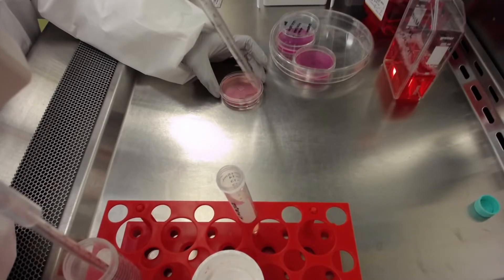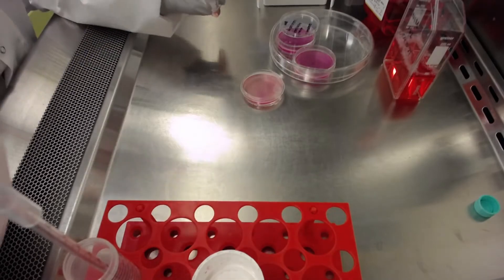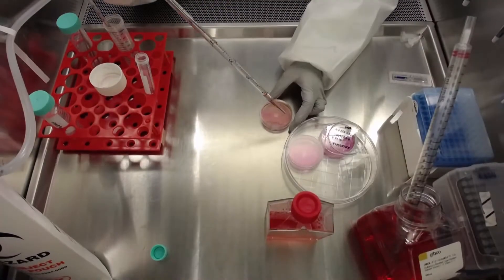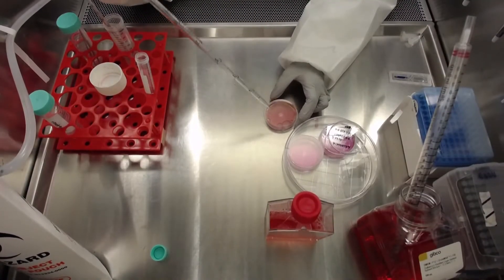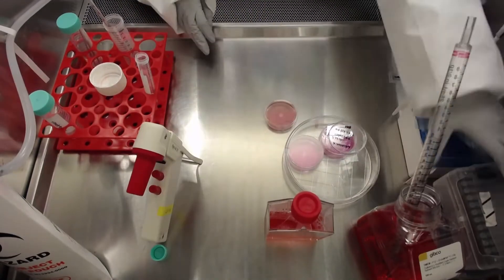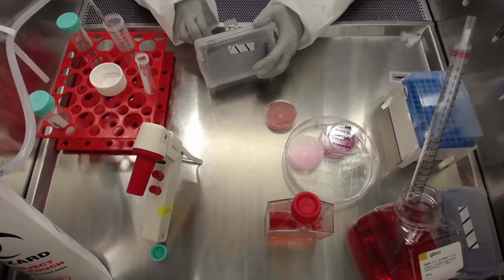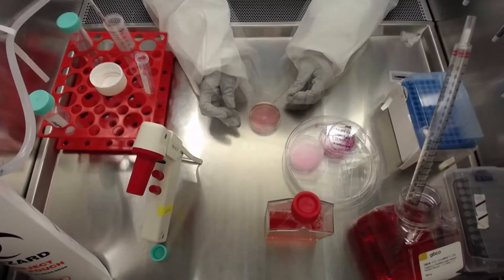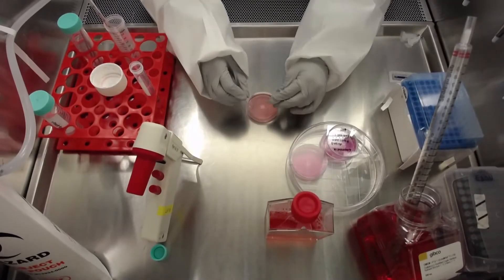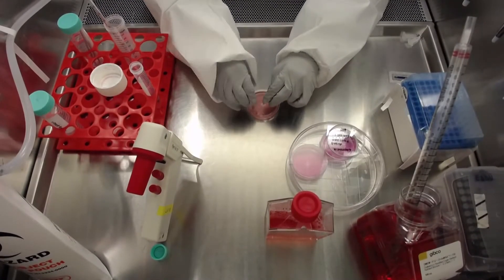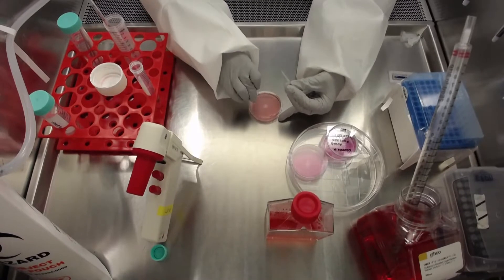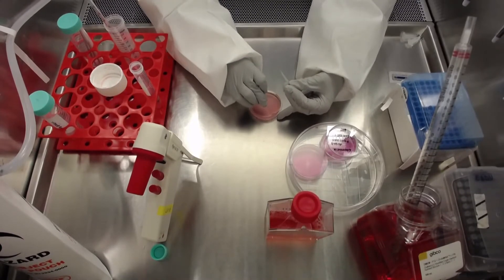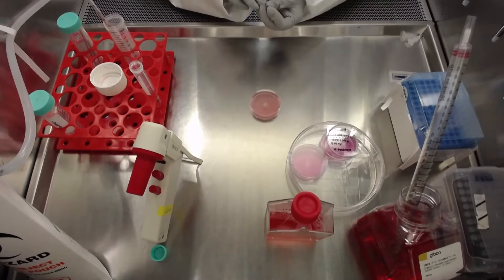After centrifugation, we add 6 milliliters of neuronal induction media with rock inhibitor to complete the volume. The extra media should be added slowly on the side of the dish to avoid disturbing the aggregates formed in the microwells. The media should fill the dish and properly cover the surface of the EB disc. Don't forget to remove the bubbles.